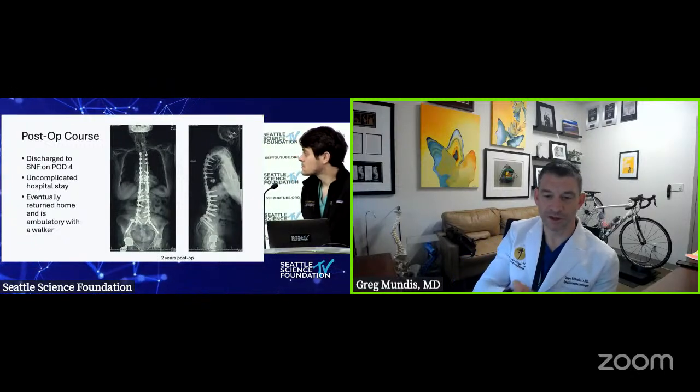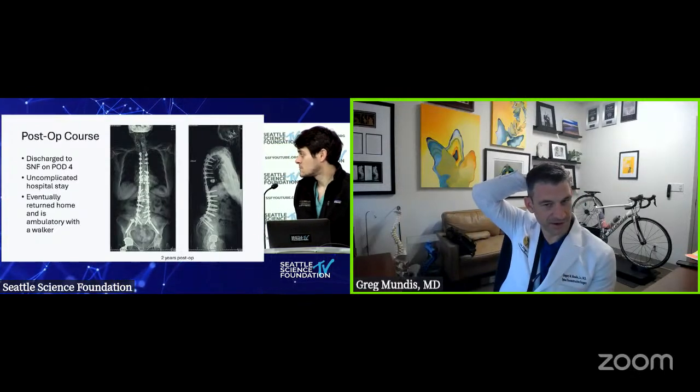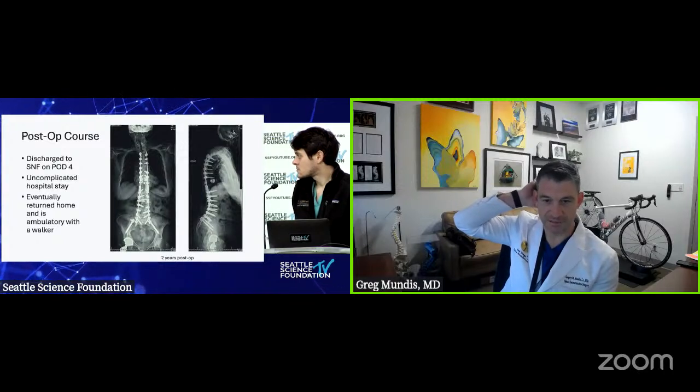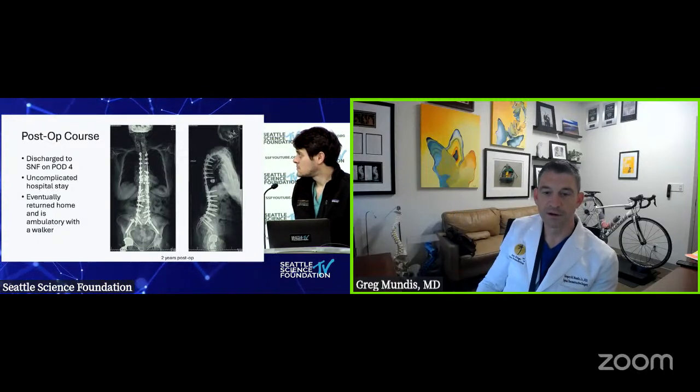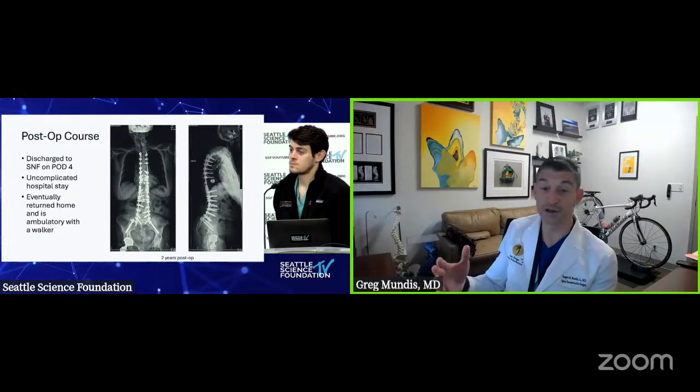And now, interestingly enough, look at her pelvic tilt. It's like it's going to 0. So I wonder if she's leaning on something there, or if she's got her walker. It looks like her arms are not forward in this.